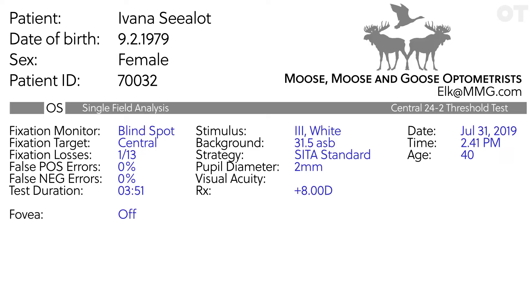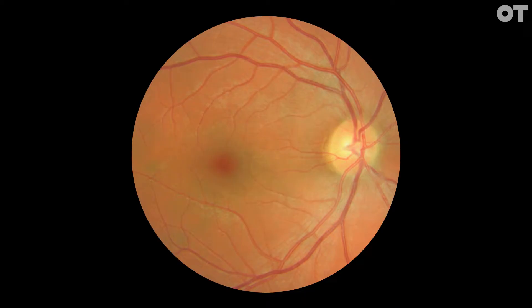Now look at the reliability indices: fixation losses, false positives and false negatives. Fixation loss is estimated by presenting a stimulus in the presumed location of the blind spot. The newer models of the Humphrey visual field analyzer have a gaze tracking record.